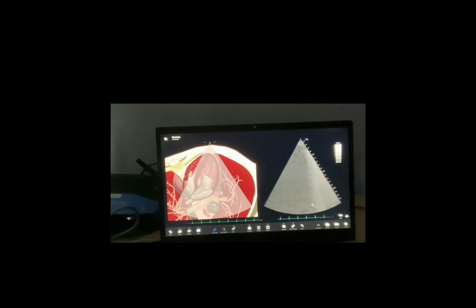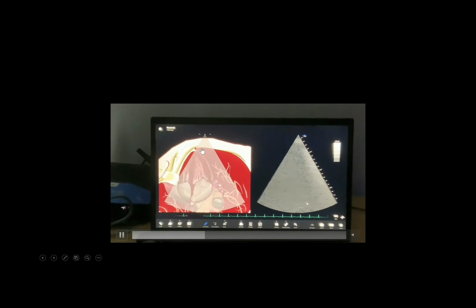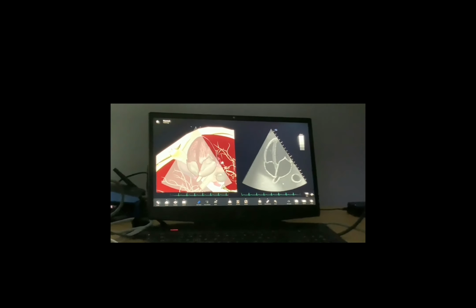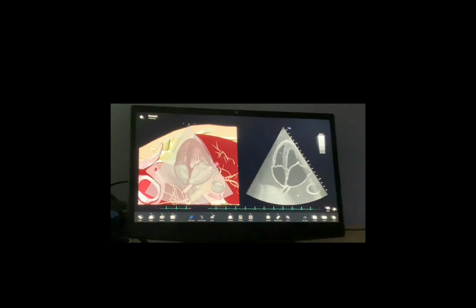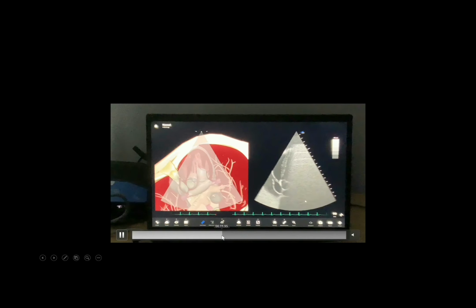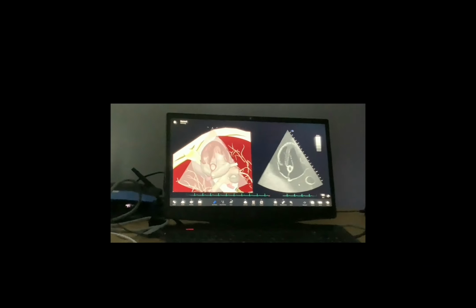So, what are the struggles that we face getting a 4-chamber view? The rib shadows, the lung shadows, it's not an easy view to get, especially for novices. Try to get any portion of the heart into your focus first. Once you start visualizing a portion of the heart like here, try to do some gentle adjustments to get the full view of your heart.